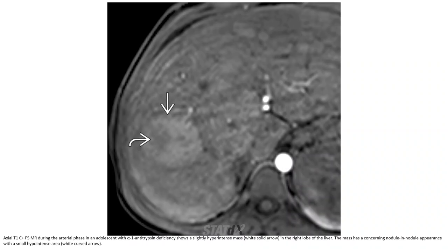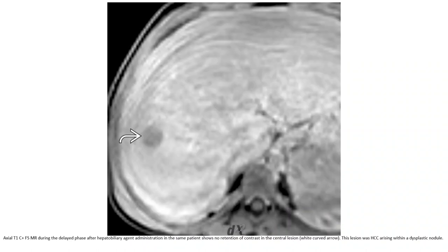On T1C+ hepatobiliary agent image during the hepatobiliary phase in an adolescent with alpha-1 antitrypsin deficiency, a slightly hyperintense lesion in the right lobe of the liver is seen. The mass has a small hypointense area. During the late hepatobiliary phase, no retention is seen in the central region. This lesion was confirmed as HCC arising within a dysplastic nodule.